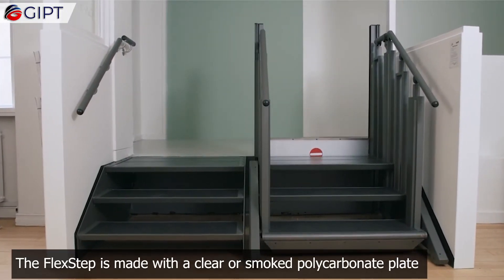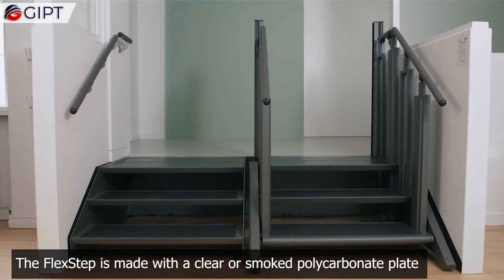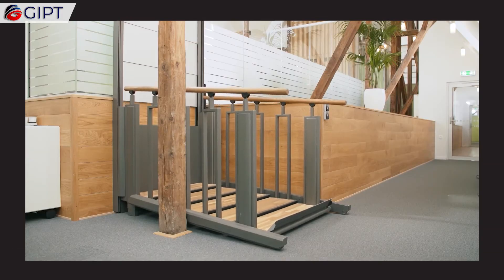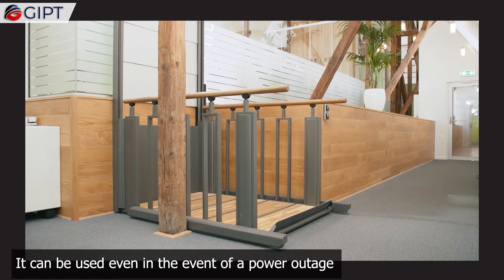The Flex Step is made with a clear or smoked polycarbonate plate and is hinged at the right or left-hand side of the platform. It can be used even in the event of a power outage.